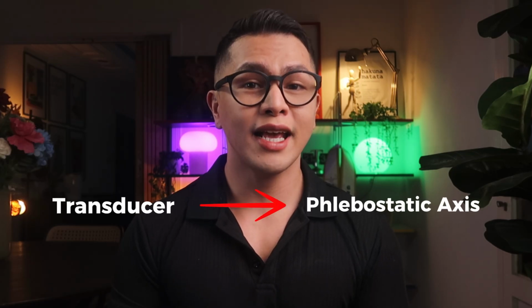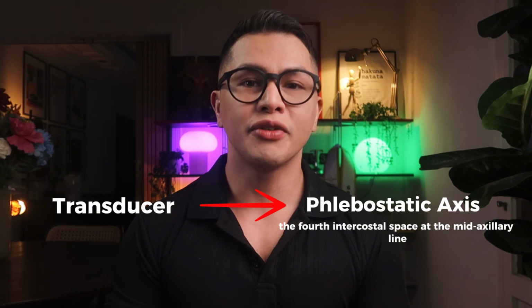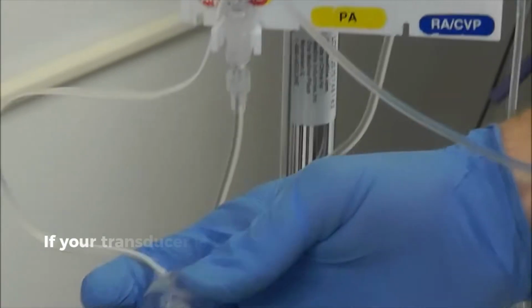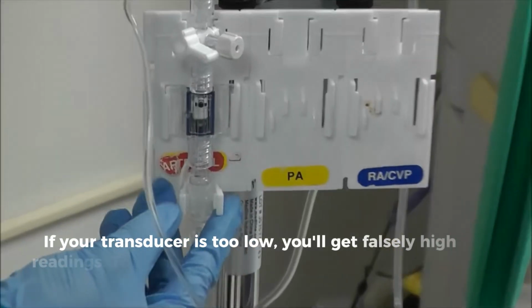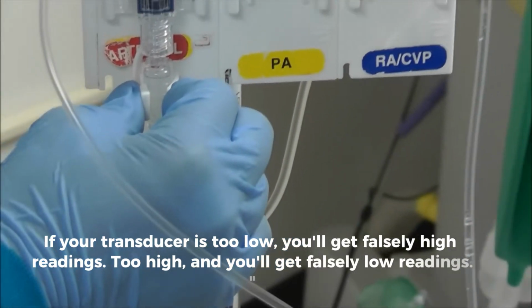Now, we get to the really exciting part. Actually monitoring your patient. And this is where you separate the good nurses from the great ones. Your transducer needs to be leveled to the phlebostatic axis. That's the fourth intercostal space at the mid-axillary line. Think of it as the level of your patient's heart. If your transducer is too low, you get falsely high readings. Too high, and you'll get falsely low readings.